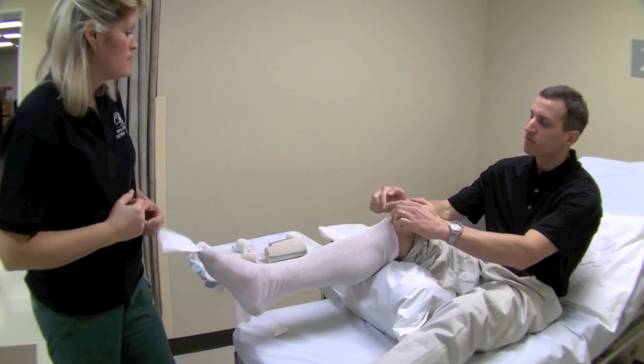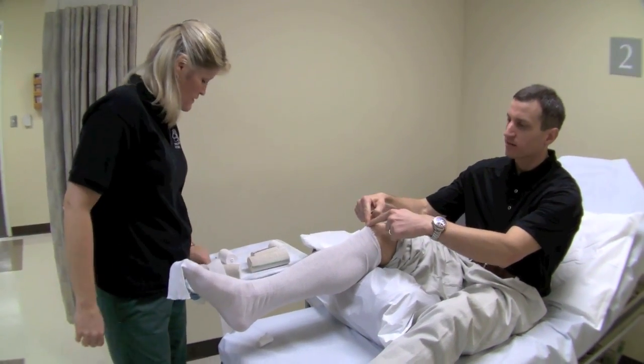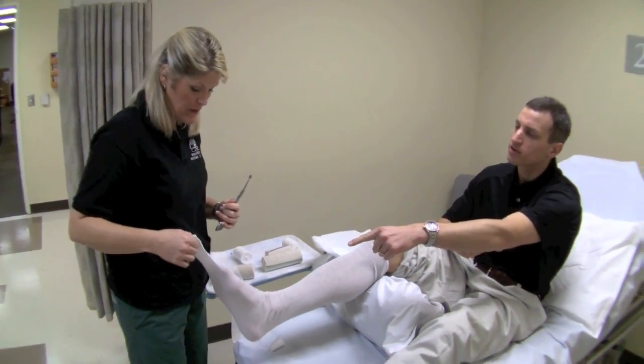The stockinette is going up right to the bottom of the patella, and then well past the tip of the toe.